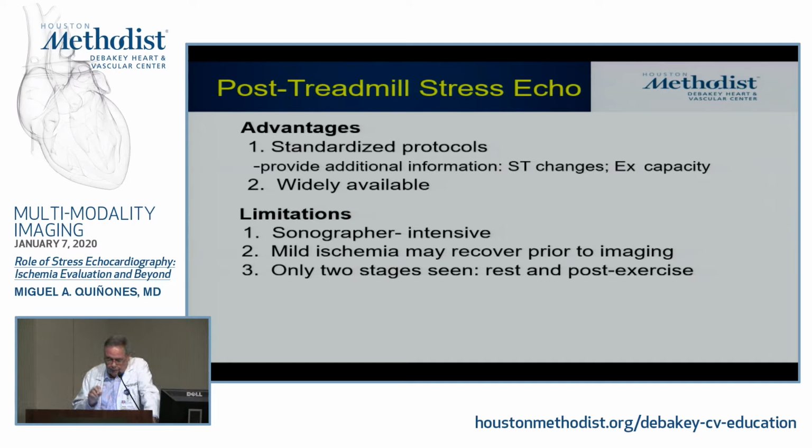Second thing is that although there is some stunning, if the ischemia didn't last too long, it might recover very fast. And that's why the dogma is that you want to obtain all your imaging within 90 seconds. So if it took you 2 or 3 minutes to get those last couple of pictures, those last couple of pictures may already be fully recovered. Now, if the ischemia did last for a while, then you may have a little bit more luxury.